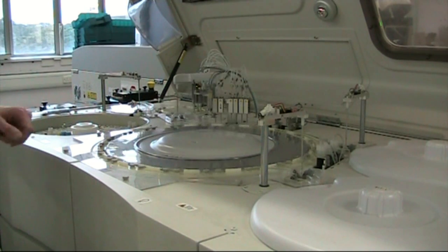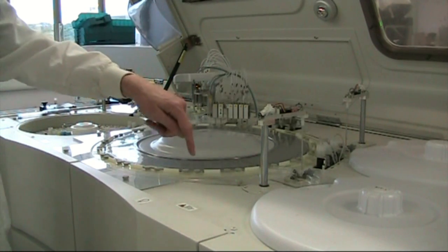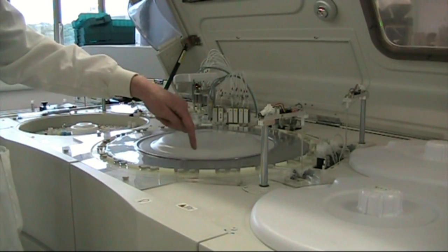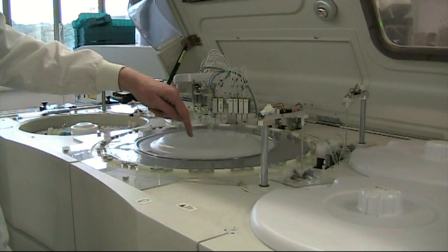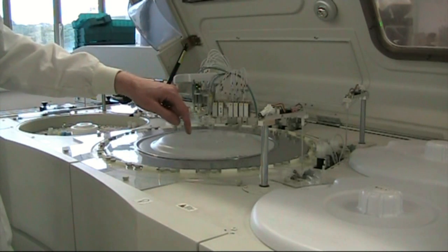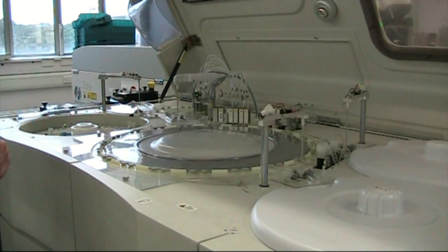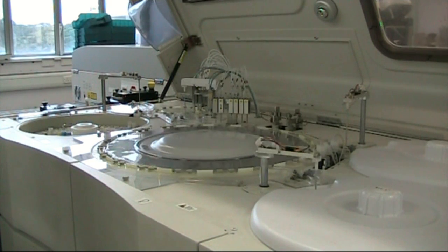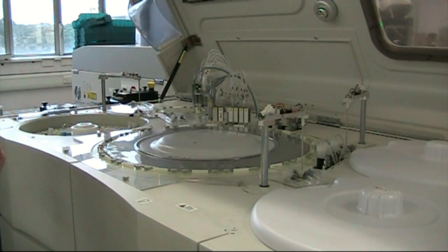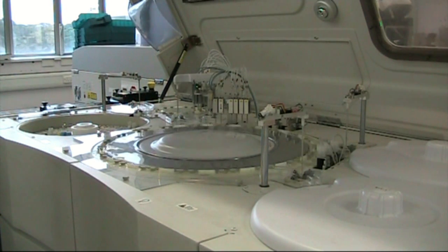And constantly, throughout the 10 minutes that the assay will take, the lamp here has a spectrophotometer on the other side, inside of the ring, which will constantly be taking absorbance readings, and these can be used to produce the result for the individual assay. So for example, if it was a glucose assay, we would produce a calibration curve using calibrators with known value, and then we would see what the absorbance reading was at the end of that 10 minutes for the patient sample and put it back into the calibration curve to produce a result in millimoles per litre.